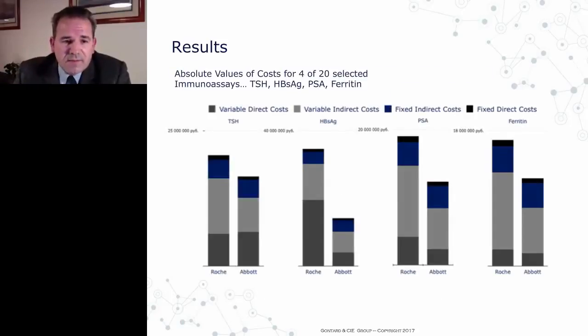And again, this study, I would like you, if you have the opportunity, to read the publication we did, because this study is platform dependent, volume dependent, and solution specific. That means that this study and the result of this study are valid for our laboratory, our volume distribution, and the platform that we had deployed at the time we did the study.